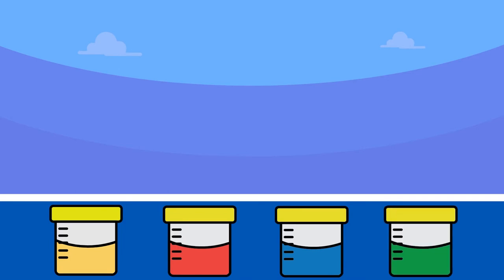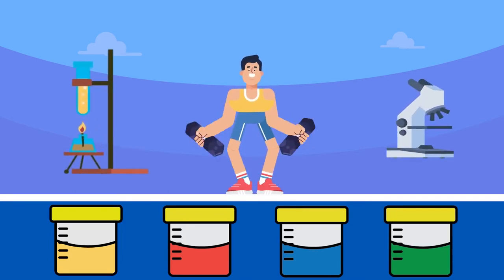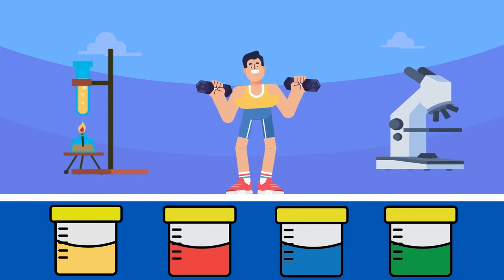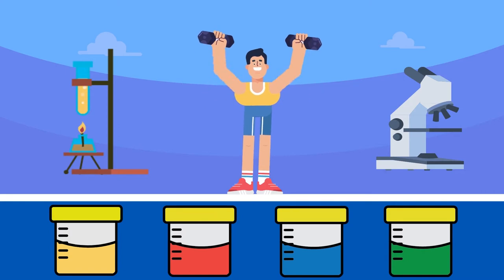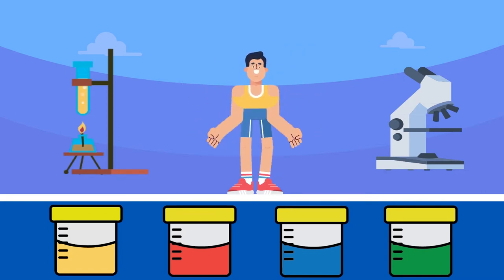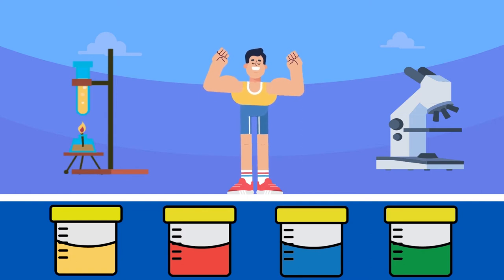What is urine analysis? Urine analysis is simply analysis of urine by looking at and testing the physical, chemical, and microscopic properties of the patient's urine sample. The urine specimens are easily obtained for the most part. Nonetheless, there are a few collection methods to help people who have difficulty voiding urine. We will also be talking about these methods in a little bit.